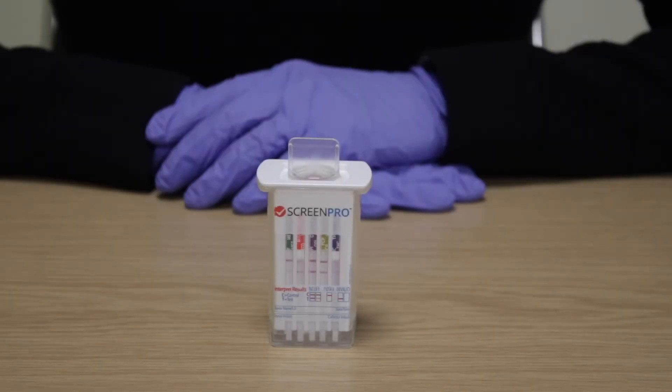Interpreting the results. You will see that the ScreenPro Oral Fluid Drug Test tests for one drug per strip, making it easy to read. Each strip has its own control line and test line. Make sure the control line at the top of the strip is visible. This indicates the strip has worked correctly.